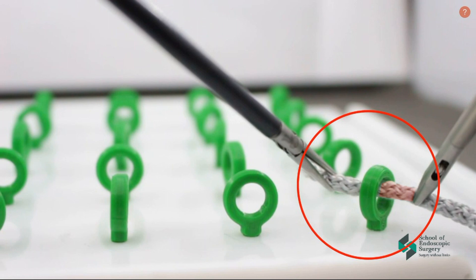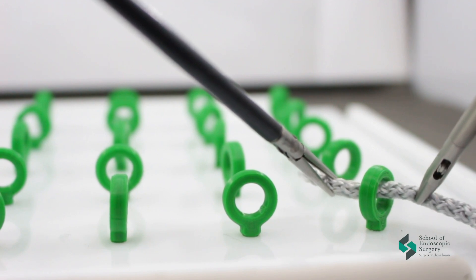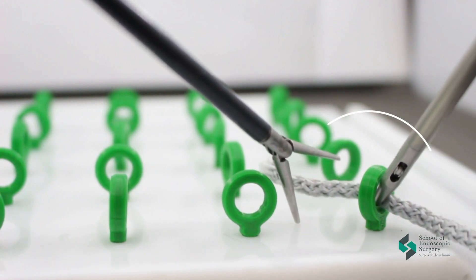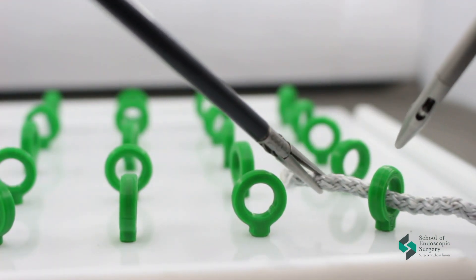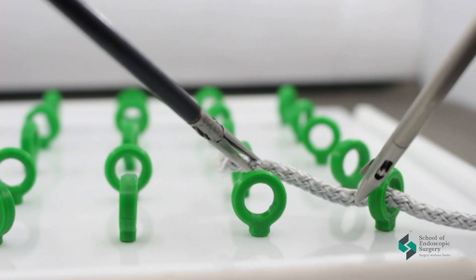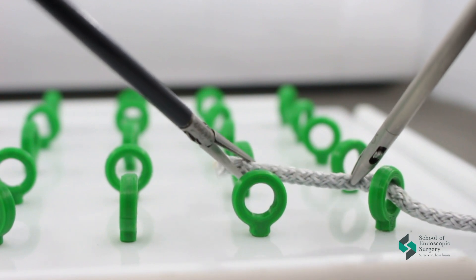It's not right to leave the thread halfway through — always bring it to the goal. After reaching the target, grab and intercept the thread. Don't forget about the tip rule.